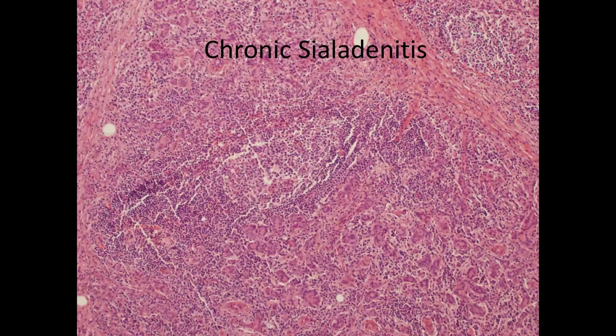So again, we have all these advances in reporting with Milan and whatnot, but I think in dealing with these aspirates of basaloid lesions, which is always the trickiest part of salivary gland cytology, I think we're still, in most cases, just able to issue a diagnosis of basaloid neoplasm and put the ball back in the clinician's court. These are cases that are usually good to do a frozen section on at the time of surgery. But it's hard to go out on a limb too much with these aspirates. Really, the main thing I try to do is just make sure I'm not overcalling a chronic sialadenitis.